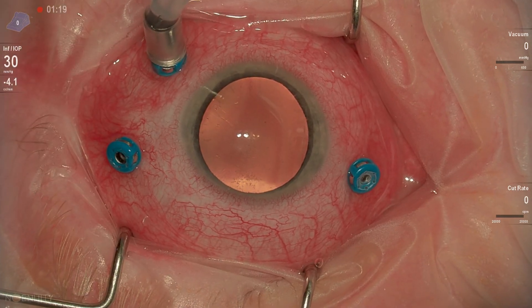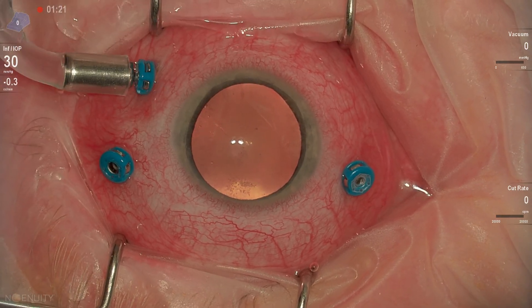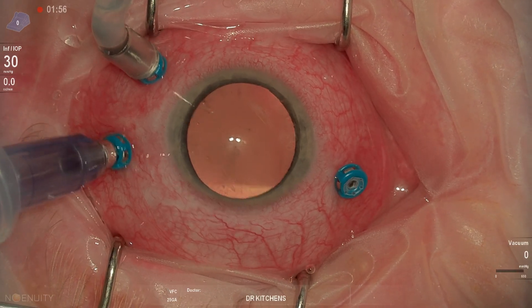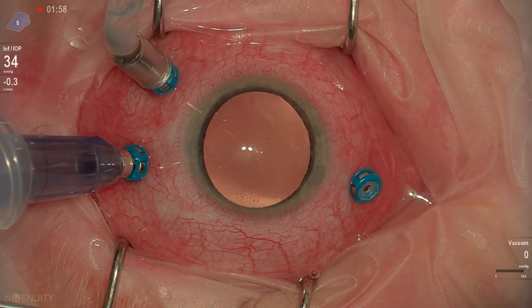This is a pretty straightforward silicone oil removal. This is a phakic patient that had had a pars plana vitrectomy three or four months prior to this for a retinal detachment.